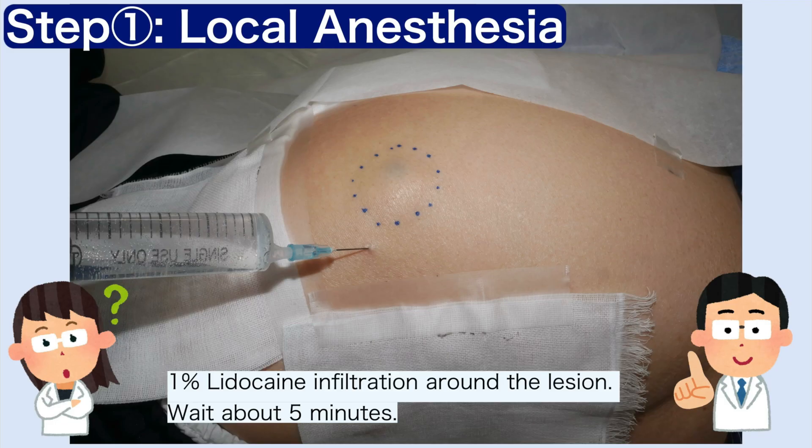Step 1. First, infiltrate the surrounding skin with 1% lidocaine in a square pattern. Allow several minutes for anesthesia to take effect.